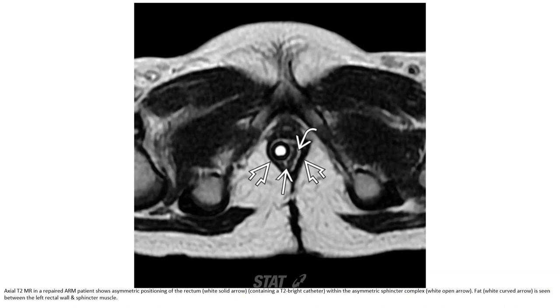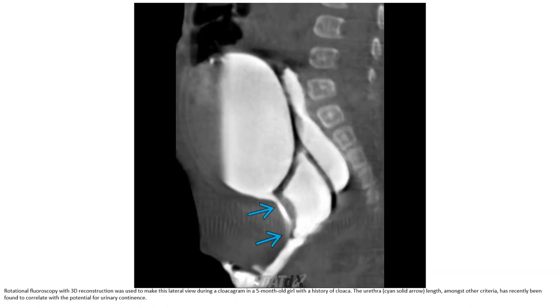Rotational fluoroscopy with 3D reconstruction was used to produce this lateral view during a cloacagram in a five-month-old with cloaca. The urethral length, among other criteria, has been found to correlate with the potential for urinary continence.